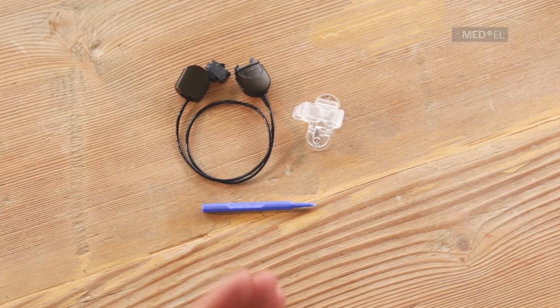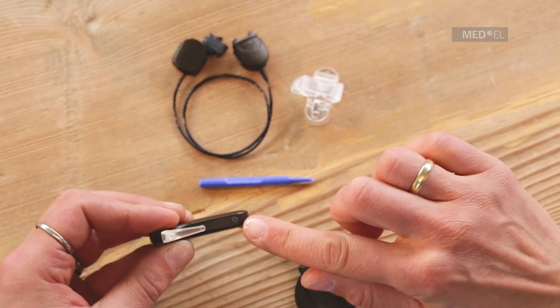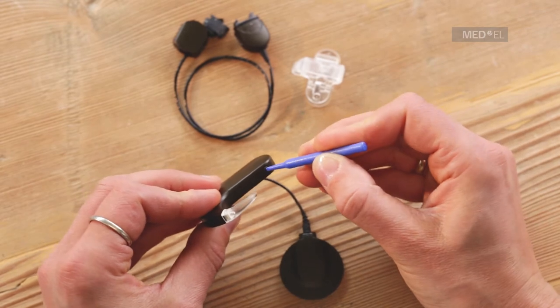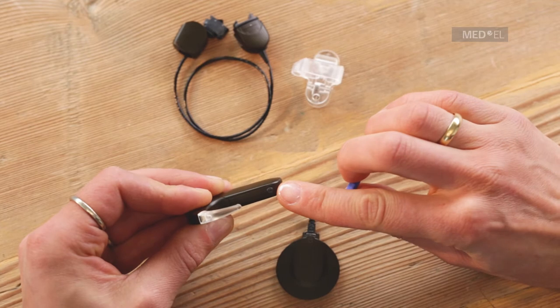To set up active wear, first remove the battery pack from the control unit. Make sure that the battery pack cover lock is in the vertical unlocked position. If it is in the horizontal locked position, use the plastic screwdriver to unlock the cover.